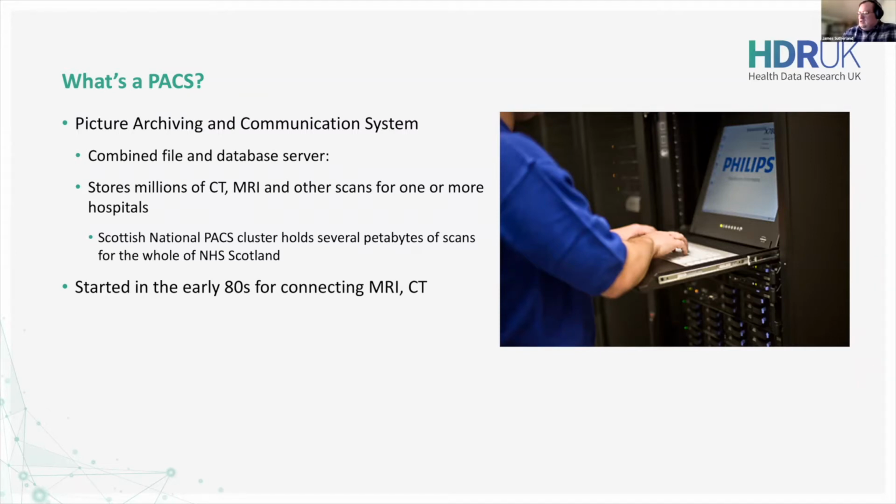Now, the concept of a PACS started back in the early 80s when companies were making and selling MRI scanners, CT scanners, putting them into hospitals, and there was a need for a better way to organize all this data. At that stage, if you had an X-ray, often it'd be a physical film one that you would go into an X-ray room, they would stick a piece of film in it, expose it, develop it, and then your medical records would have a physical piece of photographic film in with your broken arm or whatever. And that was it. There was no computerization or automation. There was just a piece of film.